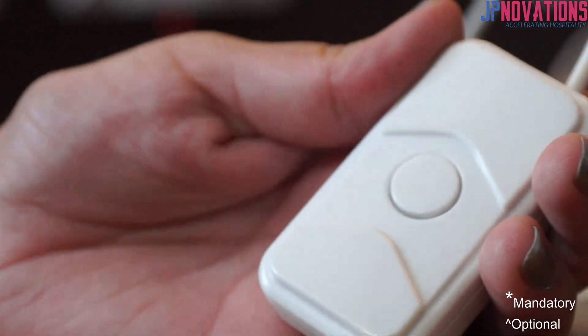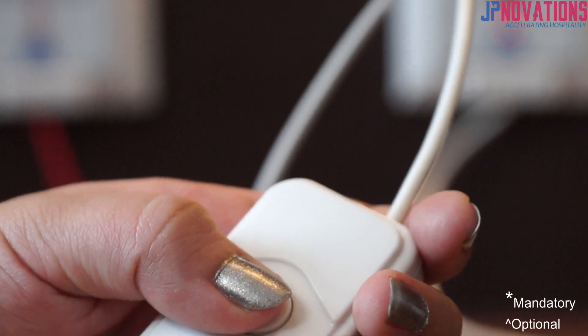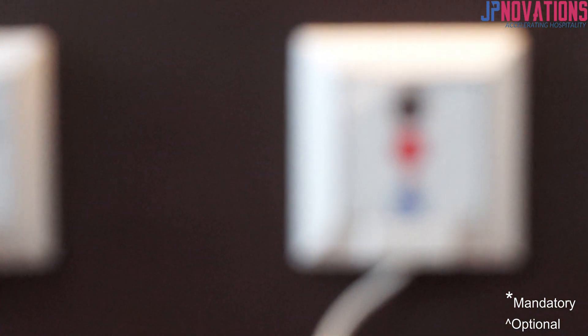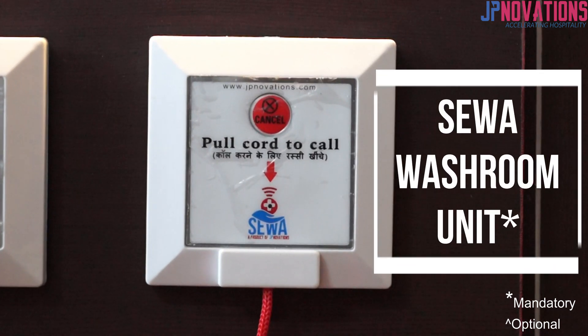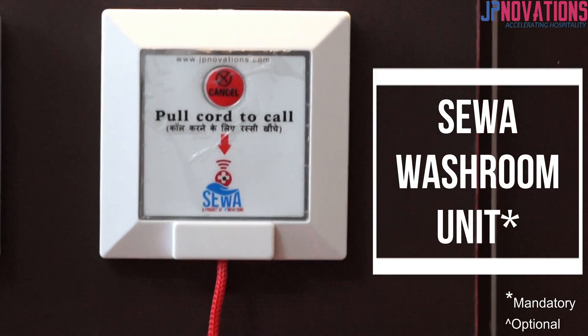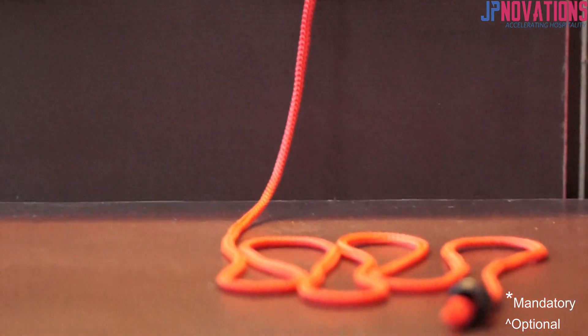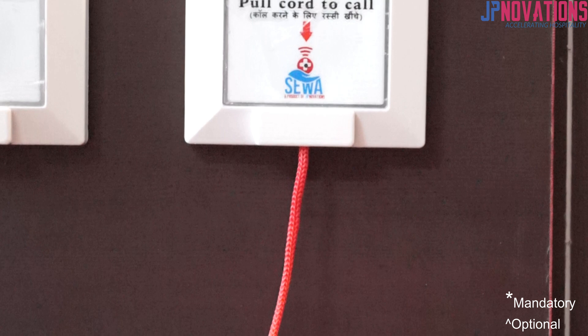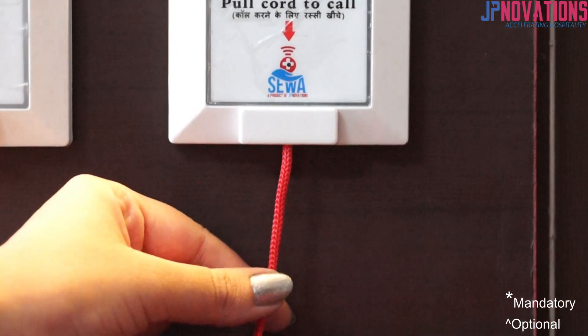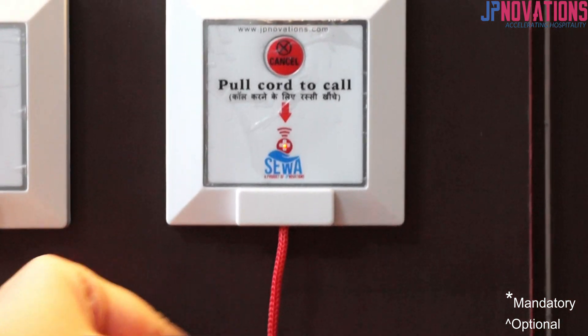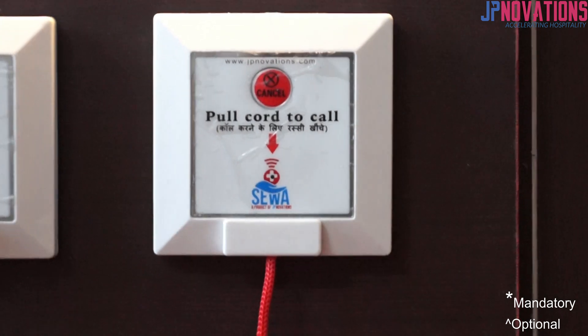This is the Sever washroom unit, equipped with one meter of pull cord for ease of patients in case of any emergency in the toilets or the washrooms. A gentle pull on the cord will help to send the call to the nurse station and deal with the emergency situation.